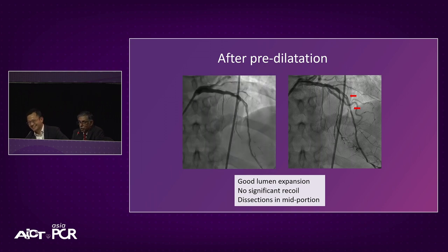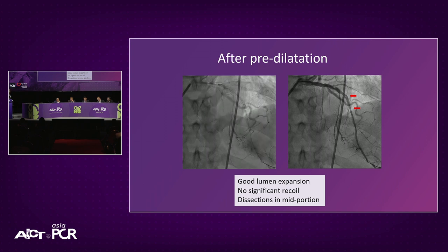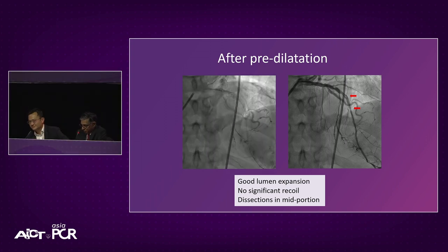Yeah, let's listen to Rosli. I would go with the angiographic findings, this good flow, DCB, and watch it for 5 minutes in the lab and then just go home. So that's a good point. If you already decided on DCB, you're just going to put DCB anyway, and whatever you see, IVUS is not going to sway you.